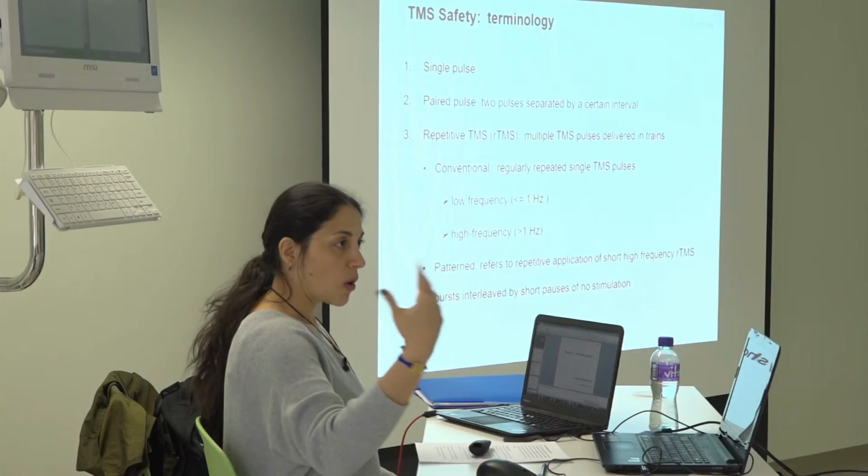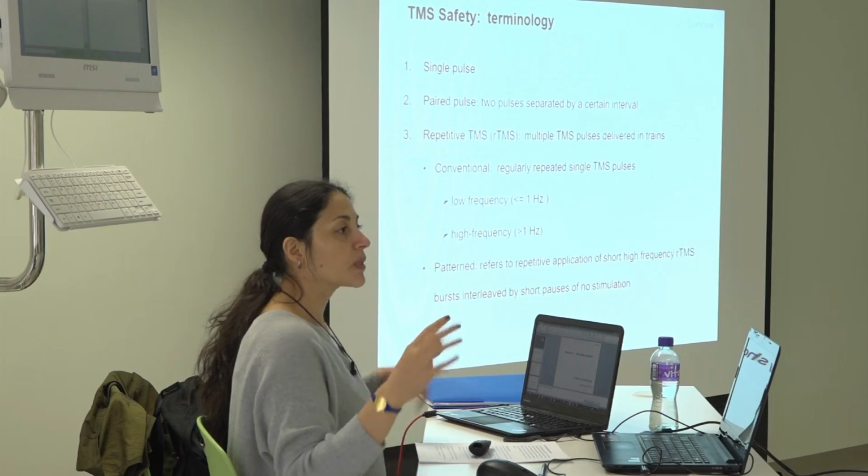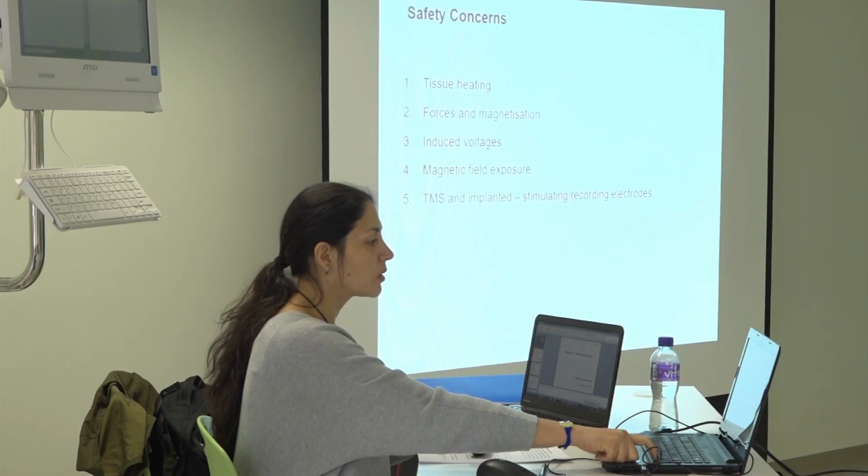Why am I saying this? Because during the talk I'll be saying that for rTMS the safety guidelines are a little bit different. With single pulse normally nothing happens, but with rTMS you can cause a seizure. So that's important to know.